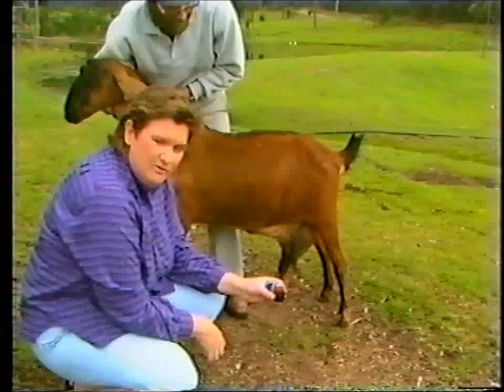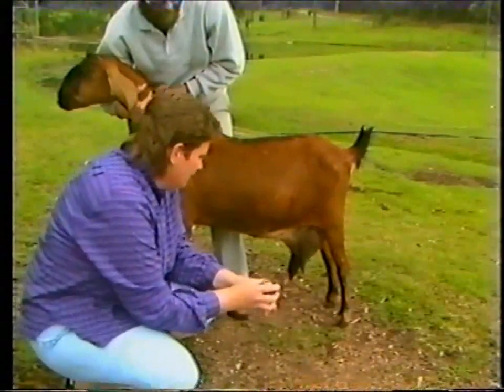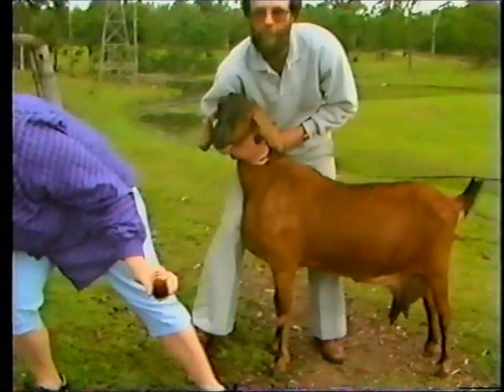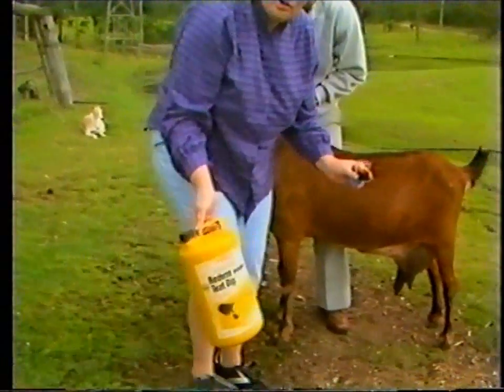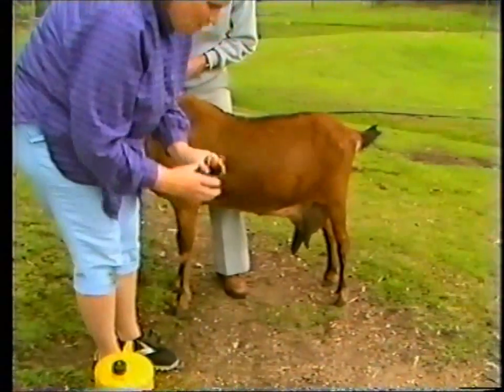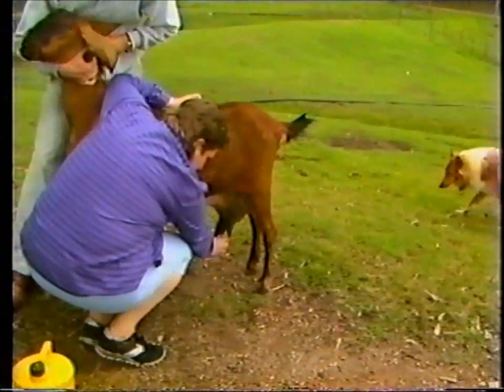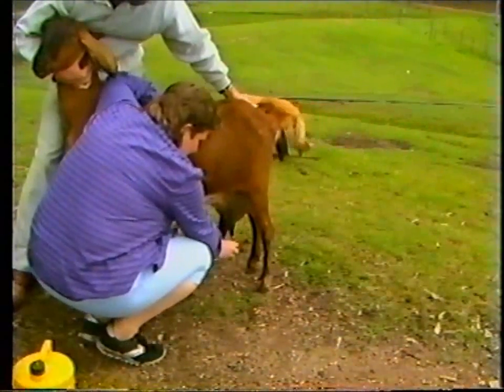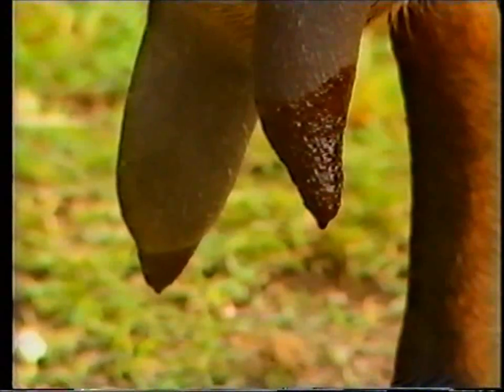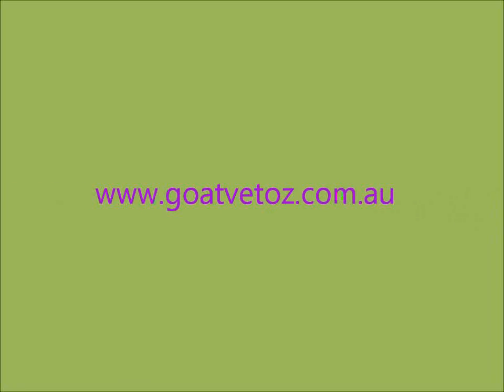Every time milk is removed from the udder of a goat, a teat-dip preparation should always be applied. Here I use an iodine-based teat-dip, which is applied to the teats every time milk is removed. Notice that you get a good coverage of the teats involved.